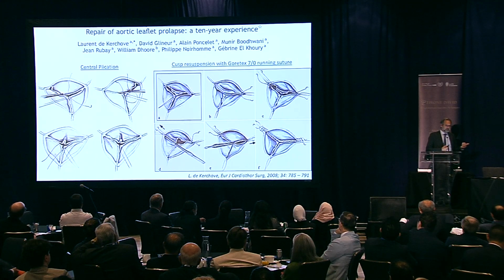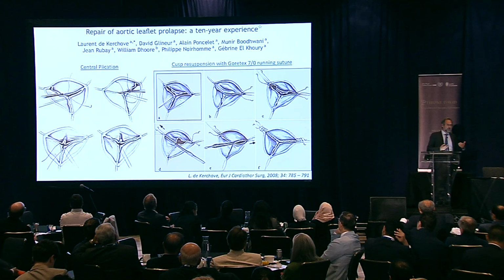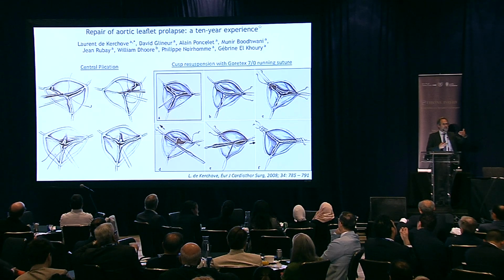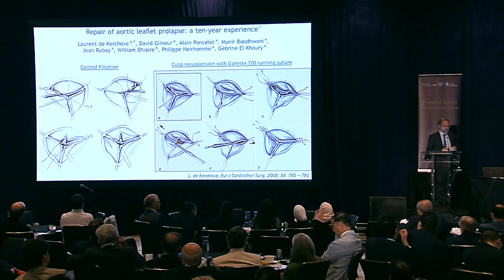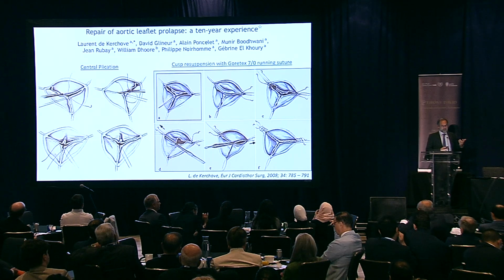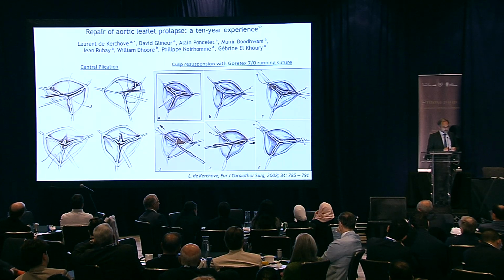Before that, there is normal tissue quantity. After the curvature, there is excess. There is not only excess on the free margin, but excess a couple of millimeters to this transverse fold. That's why we reduce that with this extension of the plication, and it has another role, to reinforce the plication that you have done.